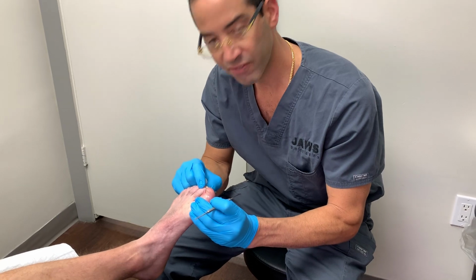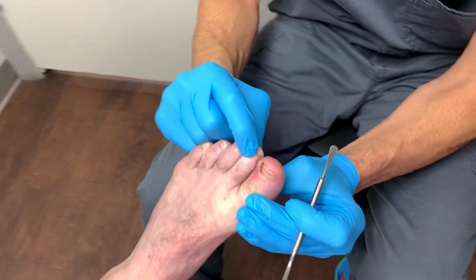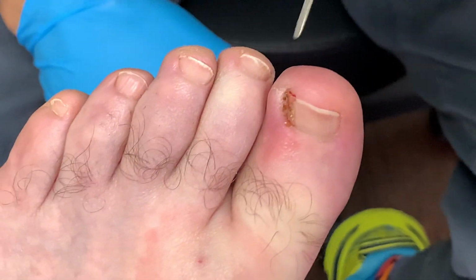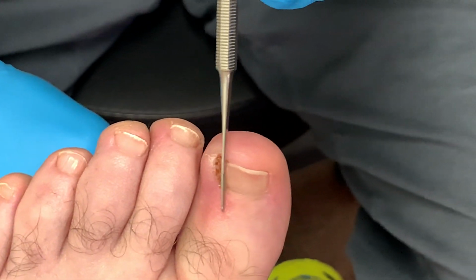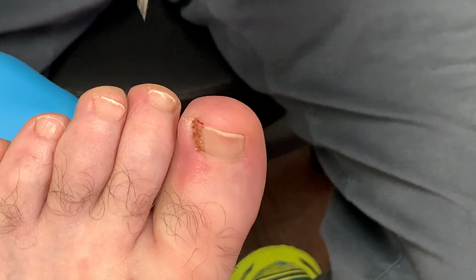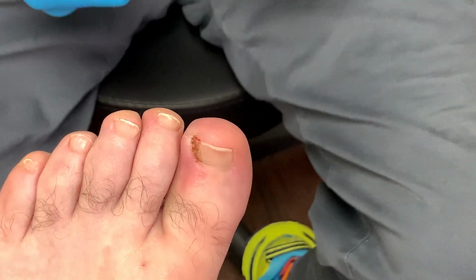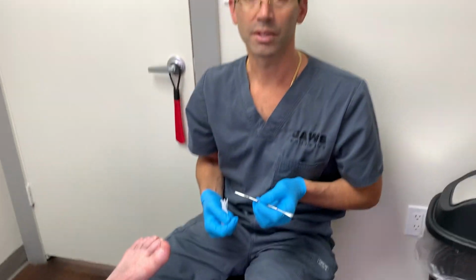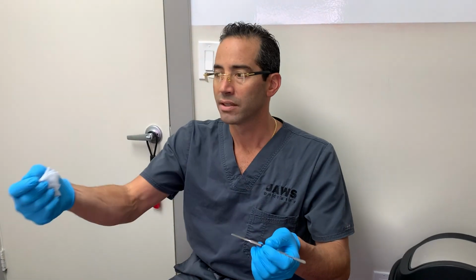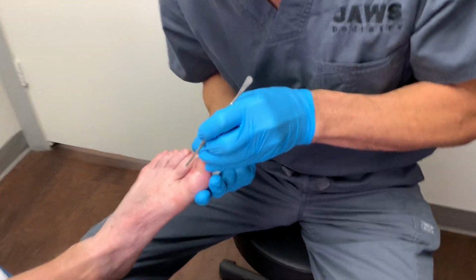So unfortunately, let's take a look here. We have a paronychia. We have all this dry, crusty drainage. We have the redness. So this is a quickie. We're just going to remove the piece of the offending nail plate, get this young gentleman back to daily life activities, get him back to exercise, and so on and so forth. Let's take a look here.